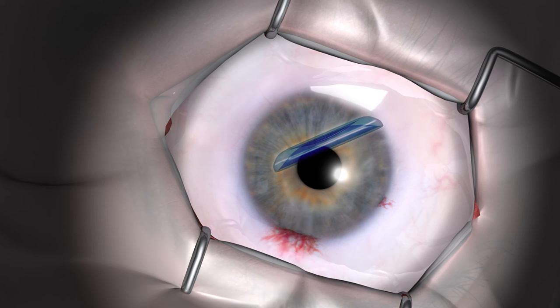Remove the cannula from the anterior chamber. Discard the cannula after use.